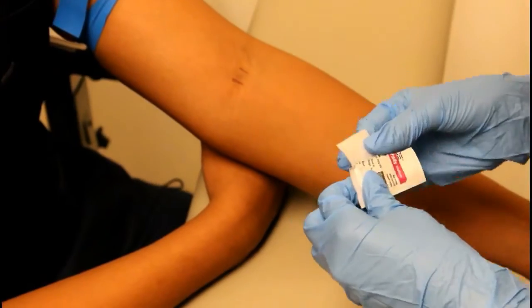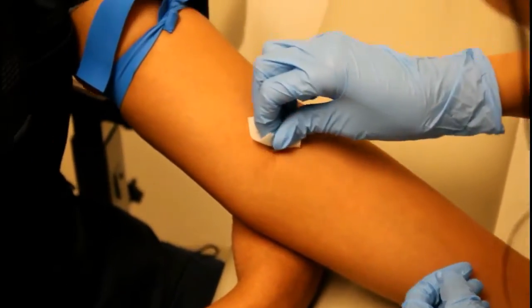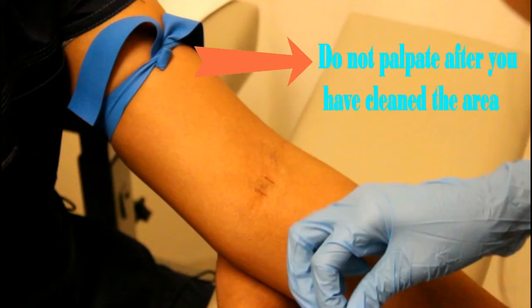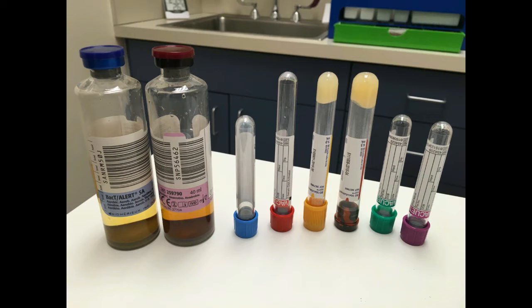Then cleanse the area with an alcohol pad in a circling outward motion. Once you have cleansed the area, you cannot palpate again. Do not blow or fan to dry the area due to contamination. Wait for it to dry on its own. While the area is drying, I will explain the order of draw from left to right.